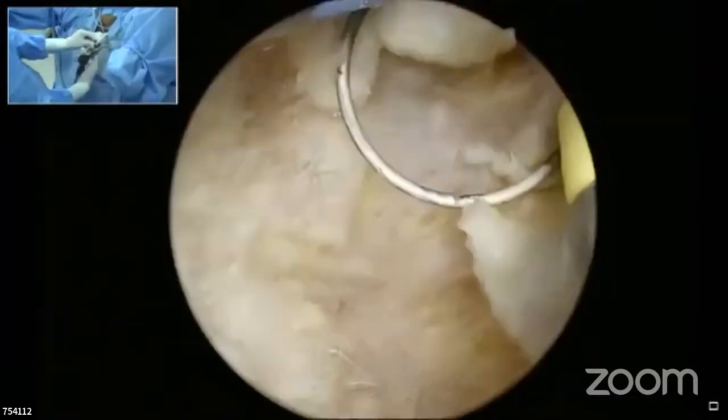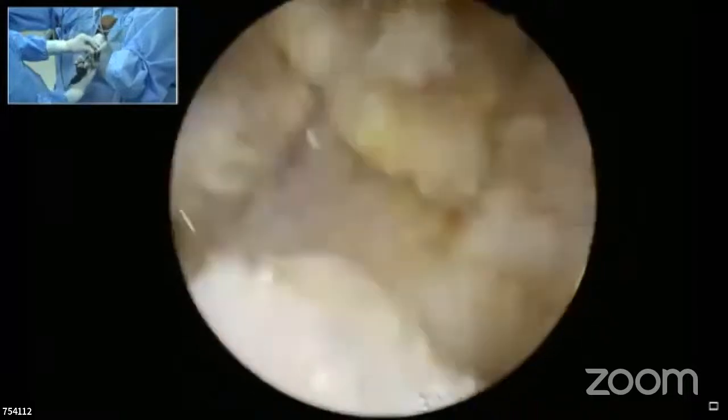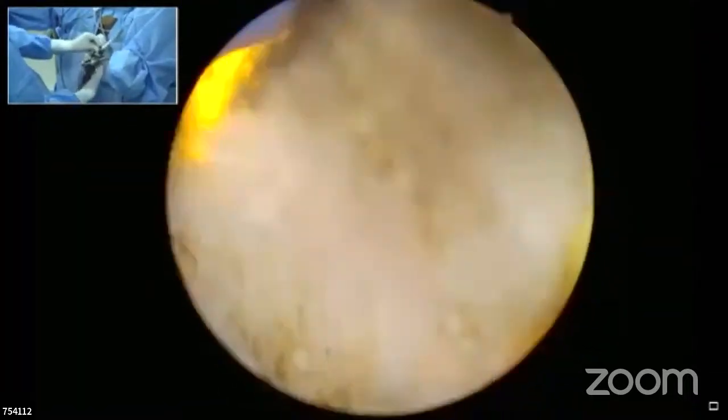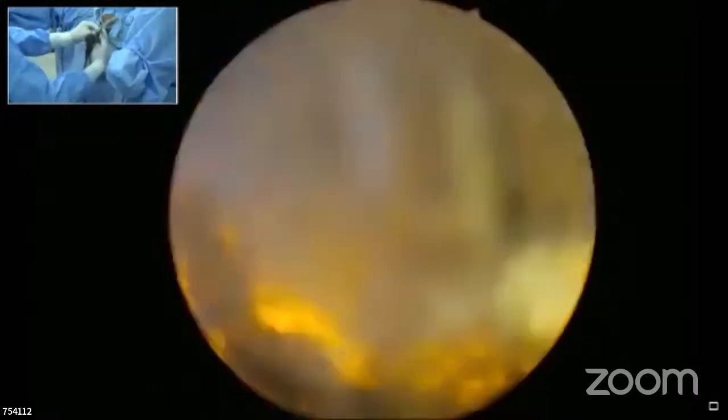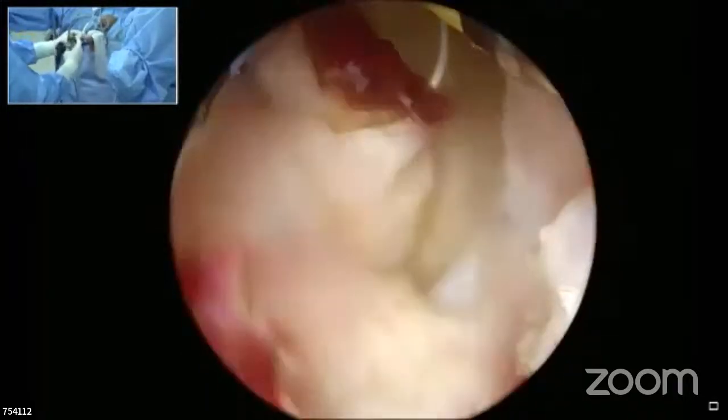And this is exactly that technique which I have demonstrated. He just sees this whole lobe can be resected very fast. So when they say, how can you resect 100 grams in 60 minutes and all that, I think his speed is also 2 to 2.5 grams per minute.